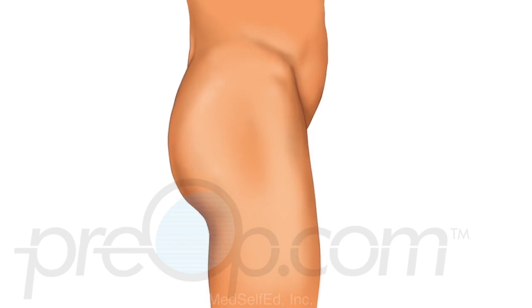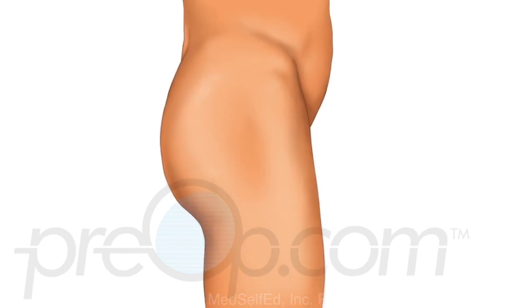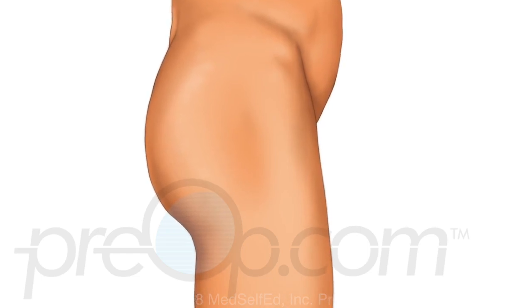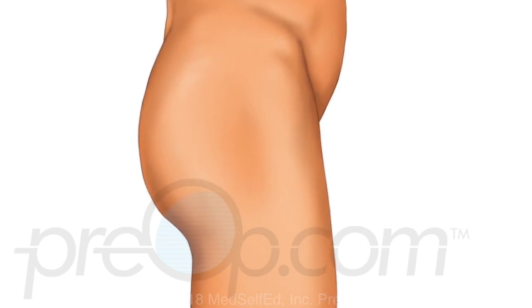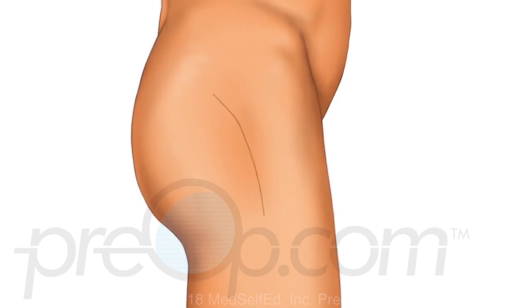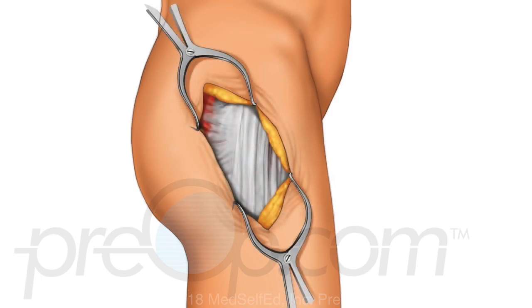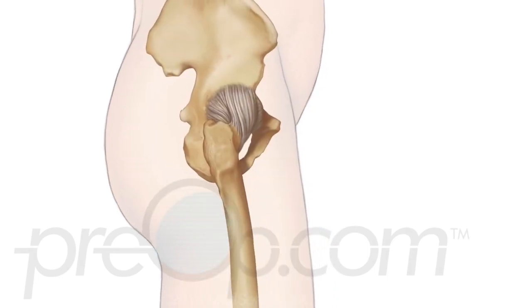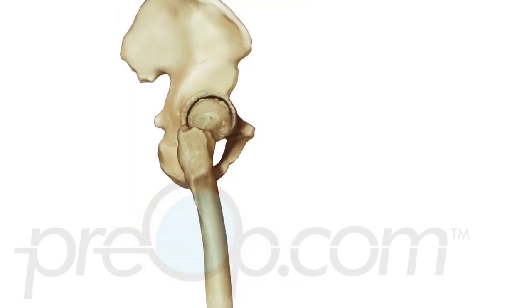Now let's look closer at the total hip replacement procedure. The hip to be replaced is marked while you are awake. You will be given medication so you will be asleep and pain free during the procedure. An incision is made near the hip joint. The surgeon works carefully through the layers of skin and other tissues to reach the muscles and tendons of the hip, and finally, the bones of the hip.